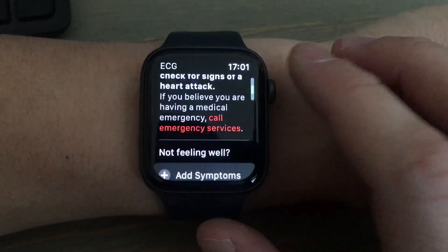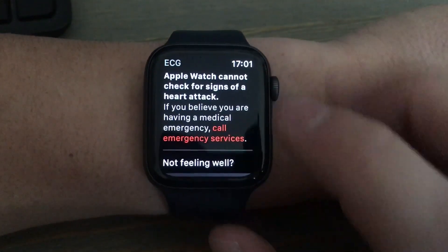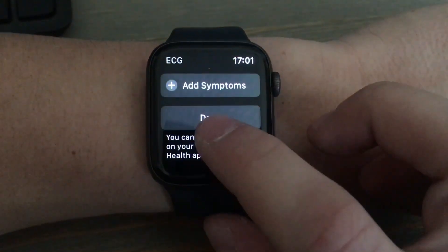I had sinus rhythm, which is a perfect rhythm. The Apple Watch does warn you that it can't tell if you're having a heart attack or not, so if you feel like you're having any problems you can hit this red button right here and it will call 9-1-1.